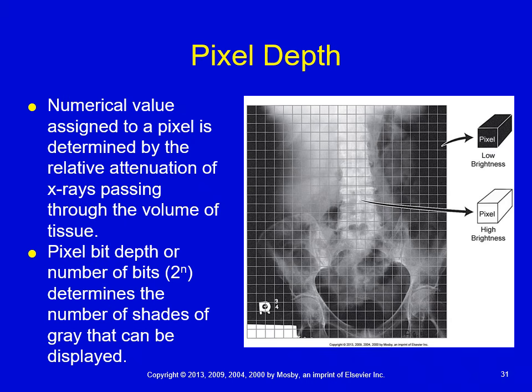All right, so that formula that you see right there, 2 to the power of n, that n is simply the number of bits that the image has. So for instance, a 4-bit image. I would take the fact that it was 4-bit and replace the n with 4. 2 to the 4th power, if you do your calculations really quick, comes out to 16.